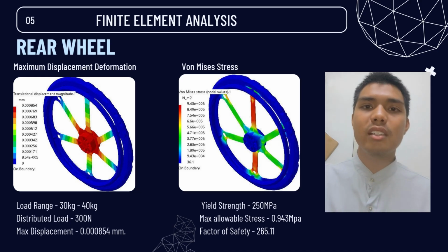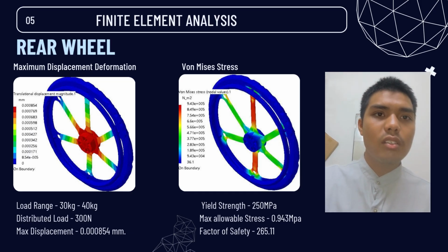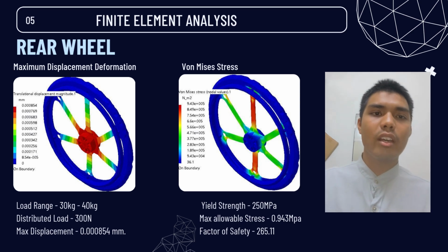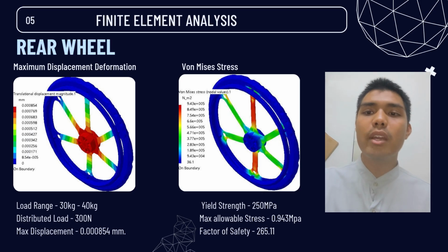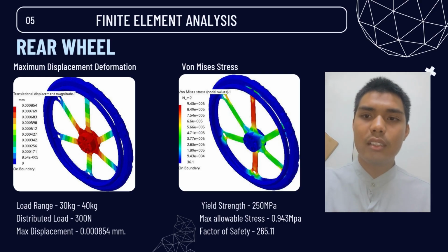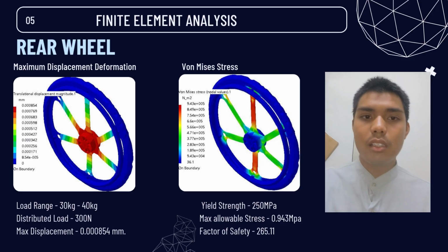So we can see here the maximum deformation is 0.000854 millimeter. Therefore, the rear wheel will not fail upon the load that has been assigned on it. So we continue on the von Mises stress. We can see here the max allowable stress, which is 0.943 megapascal. From the generated report, we get the value 250 megapascal.